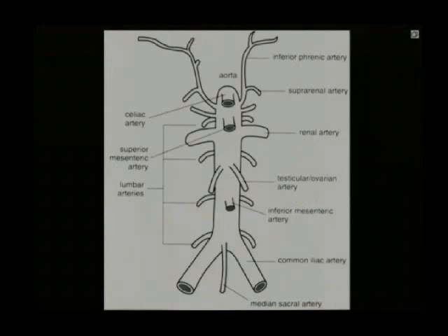And a lot of patients, again, you may not see the full aorta. You may see a segment of the aorta. And again, it's usually going to be an older patient that we're suspicious of an aneurysm. That patient could be very overweight, and it could be a difficult study. Now, with that said, usually as an aneurysm gets larger and larger, it pushes bowel out of the way. It actually gets easier to examine as it gets bigger.